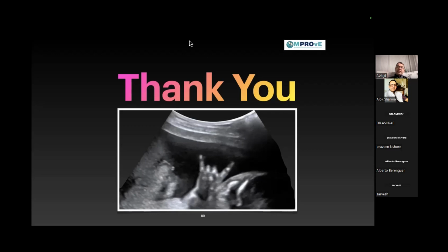As I said, the pleural sliding might be, there will be a paucity of pleural sliding. There will be altogether absence of pleural sliding. You don't know. It depends on what pathology you're dealing with. If it is a pneumothorax, no pleural sliding at all. If it is a collapse consolidation in that area, you might have some paucity of pleural sliding, or again, might not be any pleural sliding at all. So any doubt about pleural sliding, use M mode. Interrogate with the M mode to get the answer. I hope that answers the question.